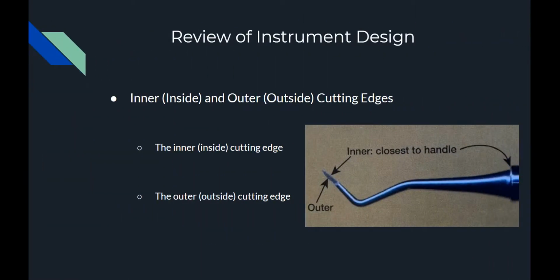Review of instrument design. The inner or inside and outer or outside cutting edges. The inner or inside cutting edge is going to be closest to the handle. The outer or outside cutting edge is going to be further from the handle.